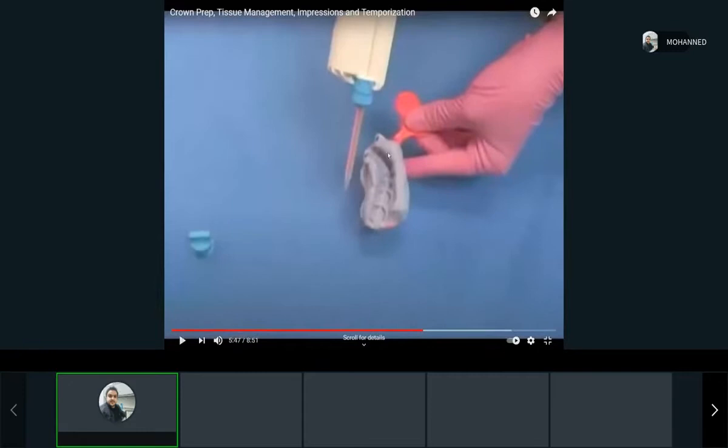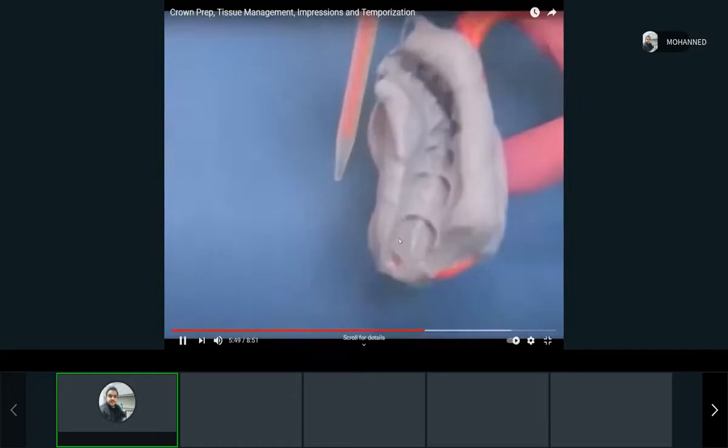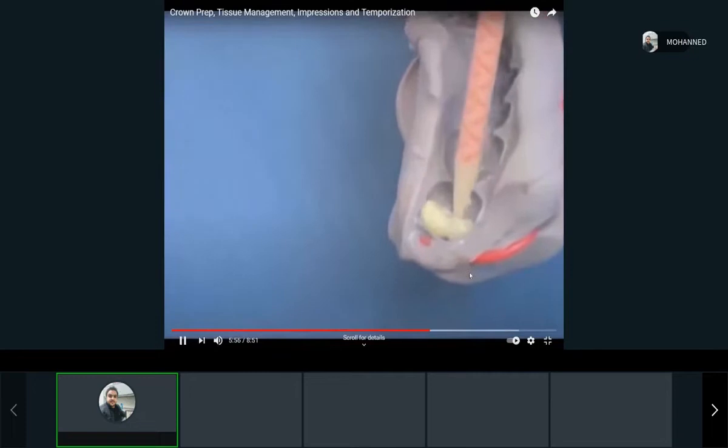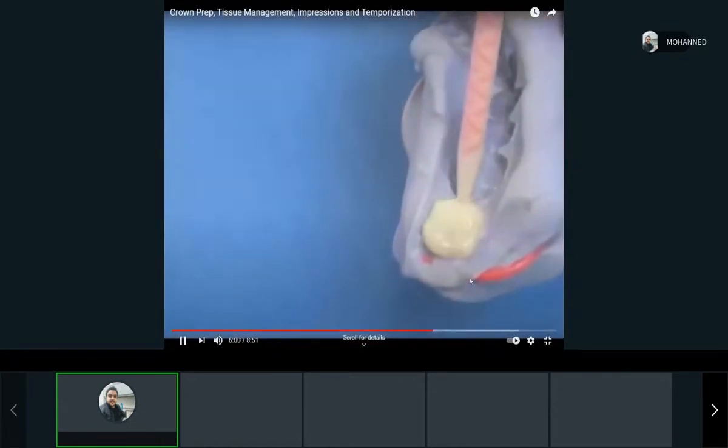Now, what was this impression? That was the first impression that we took in the video, right? The first thing before preparing the teeth. And the material that they're going to put on it is plasticky material that is crown material. You'll see they will put it only on the teeth that were prepared, because these now look like the original teeth, right? Before we prepare them. So we're going to fill them up. Again, we're going to do all of that in the lab and, sometime, most probably next semester.